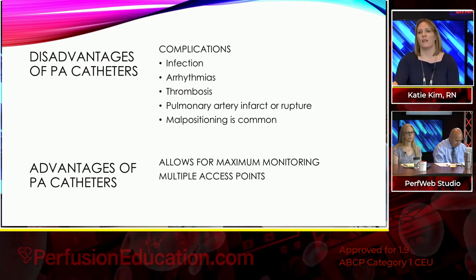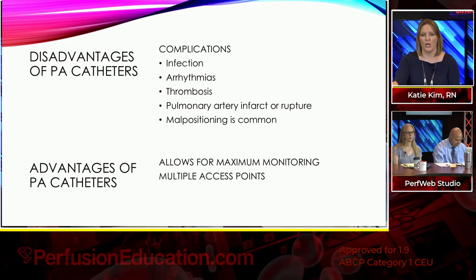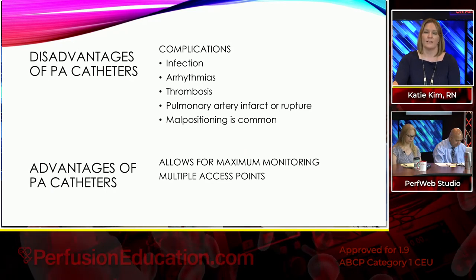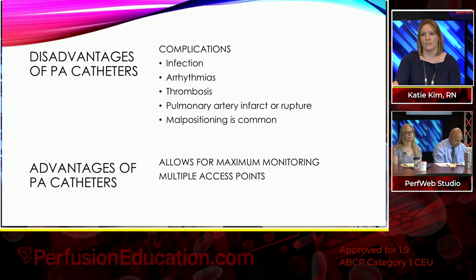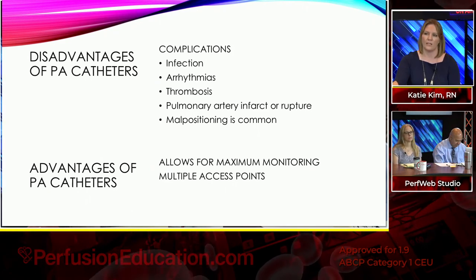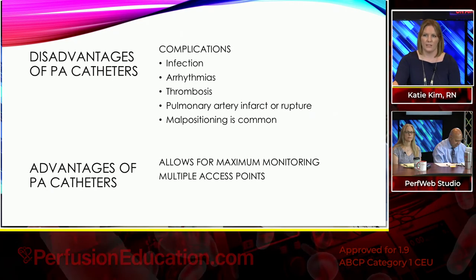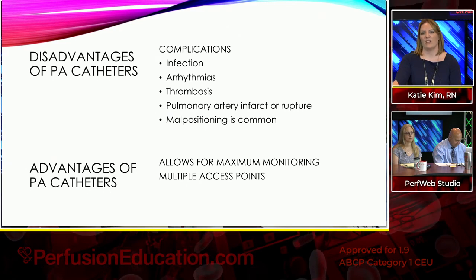But the most common thing that happens in the nursing world, at least, is malpositioning. So it'll either be advanced too far, or more often, something will get pulled, or the catheter won't be locked into place, and so it'll get pulled out a little bit, and then you have to call someone in and get it repositioned, which is always kind of a pain, and not very fun to deal with.